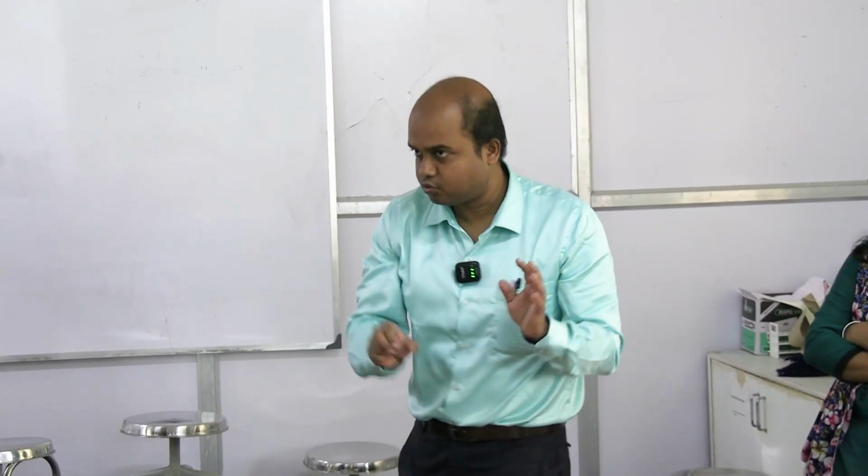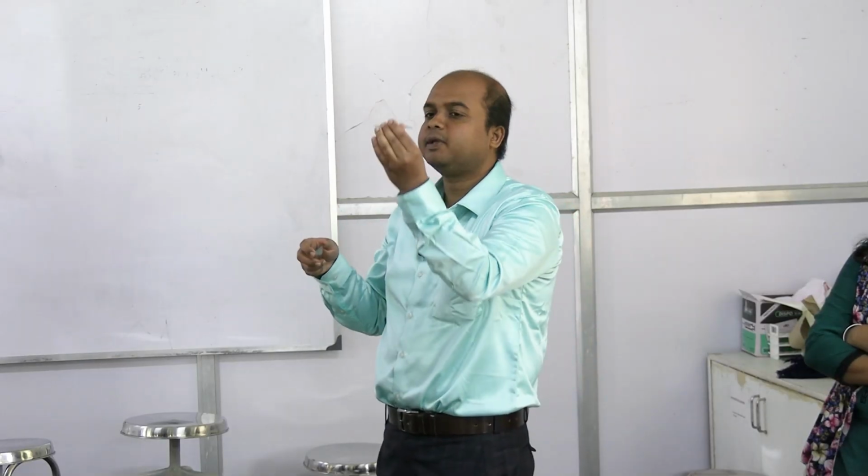And now each part, each step is important. Without spreading, if you try to draw the smear, then it will not be a good smear. Allow the blood drop to spread. After spreading, just consider this is over the surface, not in my hands. I am keeping it in my hands just to show you.